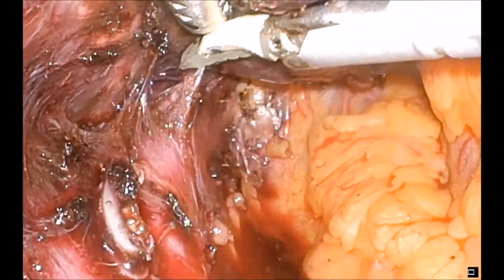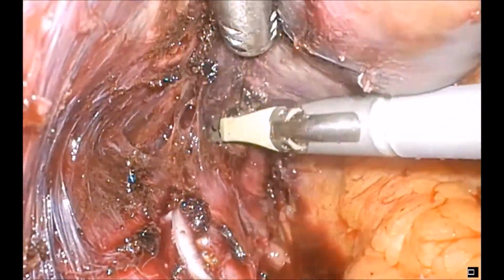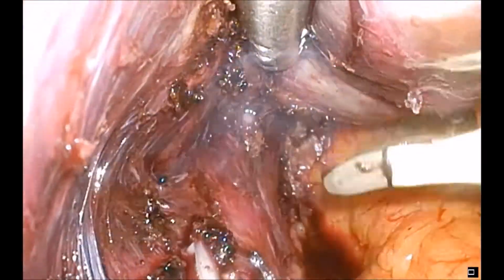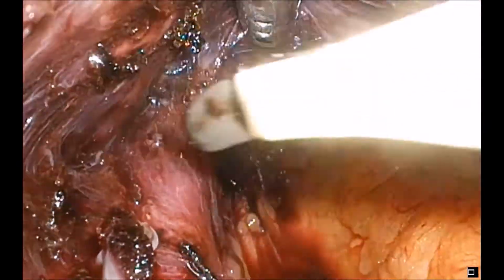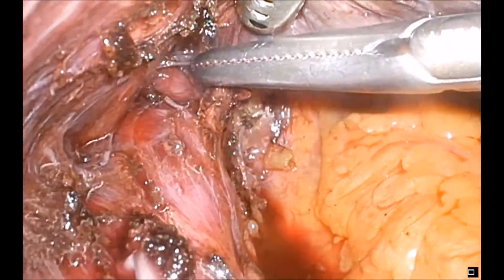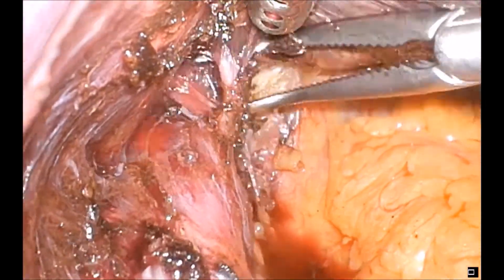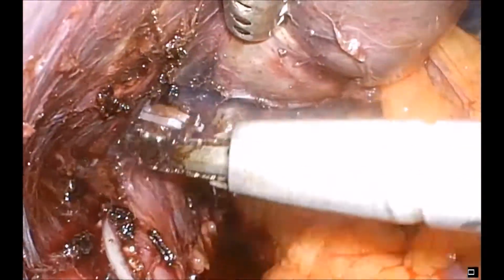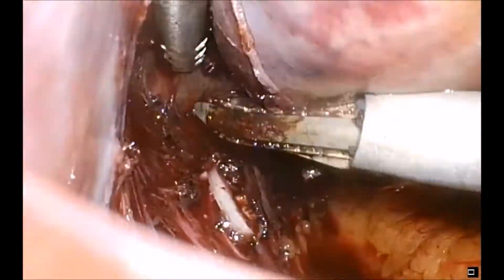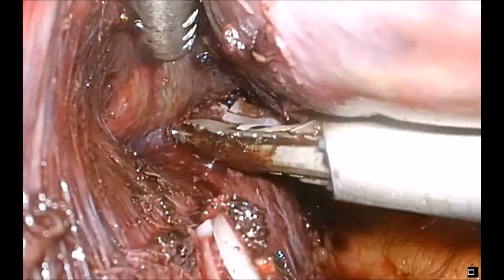Further dissection along the inferior vena cava is happening at this point. There'll usually be 2 or 3 substantial tributaries to the inferior vena cava coming from the caudate lobe directly that will need to be formally ligated, as you can see in this picture.